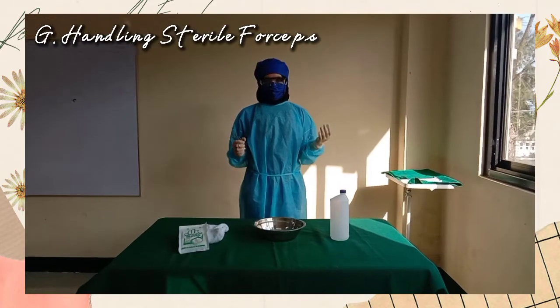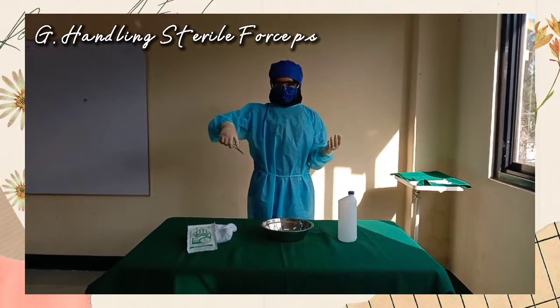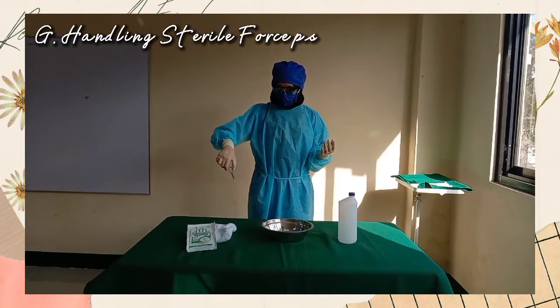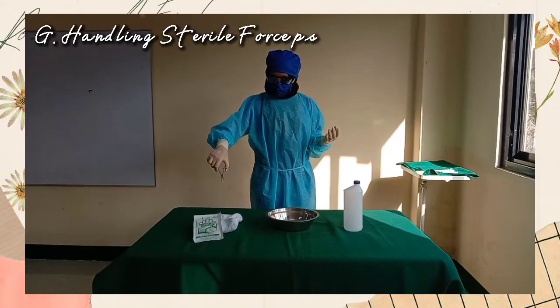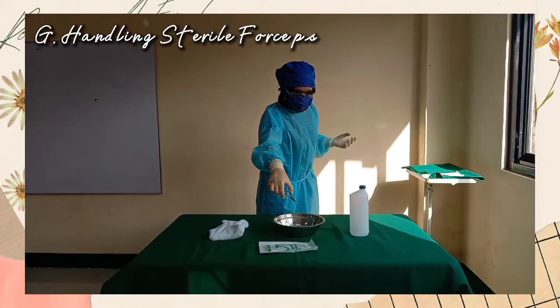Keep the tip of wet forceps lower than the wrist at all times. This prevents fluid from flowing to the handles and later back to the tip, making the forceps contaminated. Hold sterile forceps above waist level. There is less danger of contamination if the forceps are held near eye level. Hold sterile forceps within sight to prevent contamination.